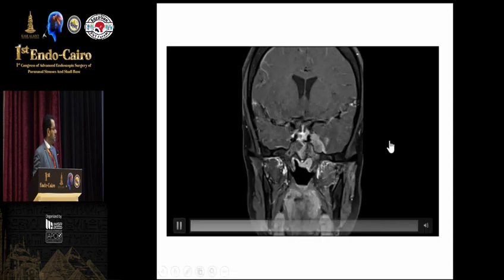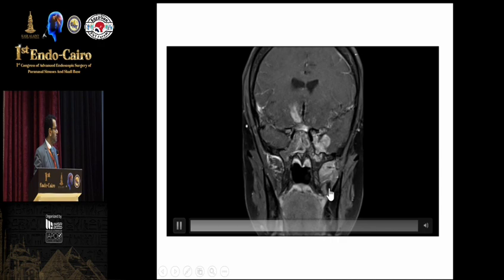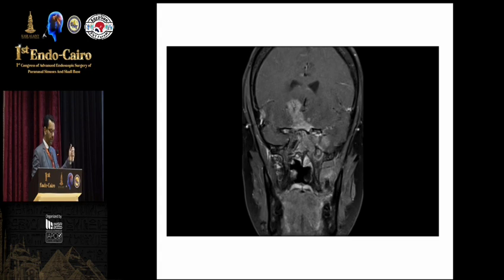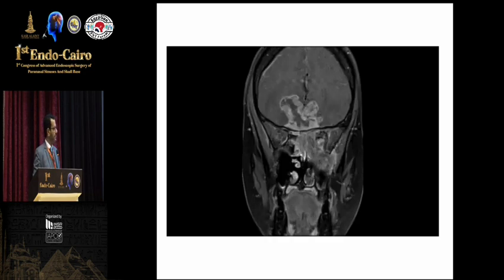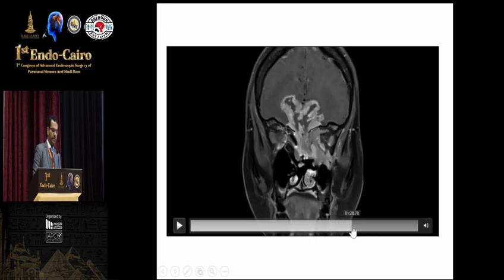I guess you are starting to see the lesion, and in the temporal lobe, you have also lesions all the way anteriorly in the cavernous, and you're going to see also in the frontal, sinonasal, with extension into the pterygopalatine and the infratemporal fossa as well, pretty extensive. She was unlucky. So all the way anteriorly.